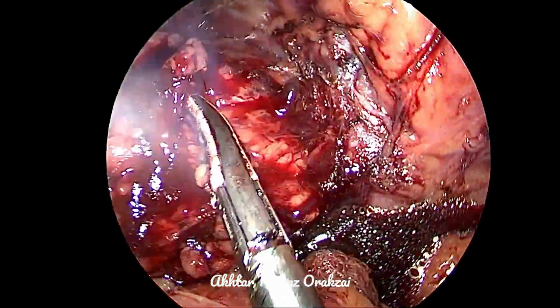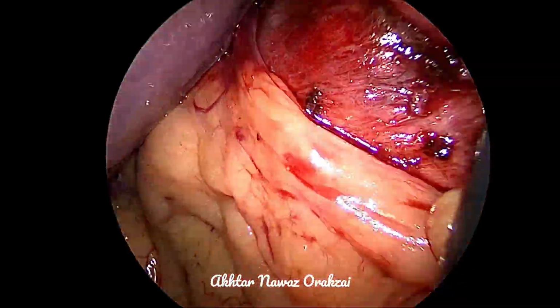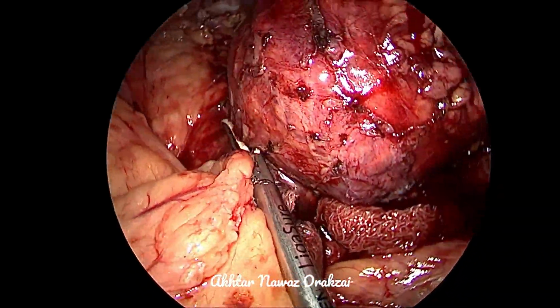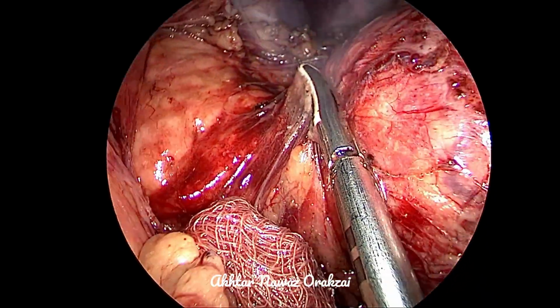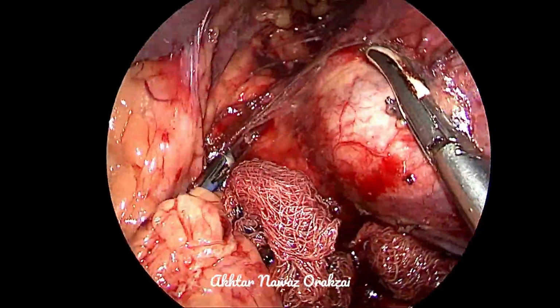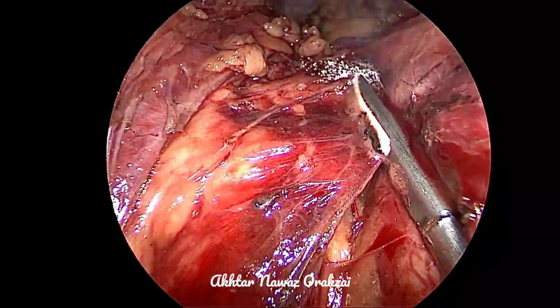You can see a lot of ooze on the surface of the adrenal gland, and the veins on the adrenal surface are getting engorged, and that is the reason, because the venous drainage has been blocked, and still there is arterial supply to the adrenal gland. So there are usually 3 arteries on the left side.